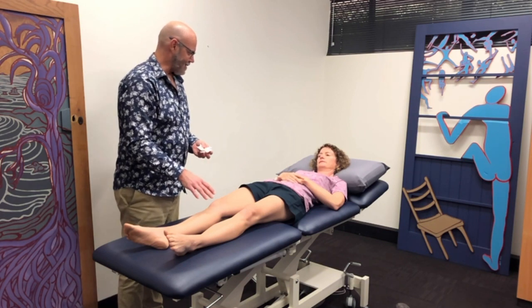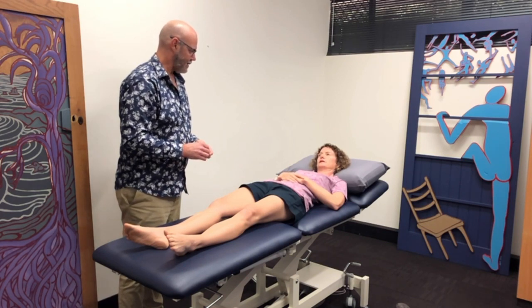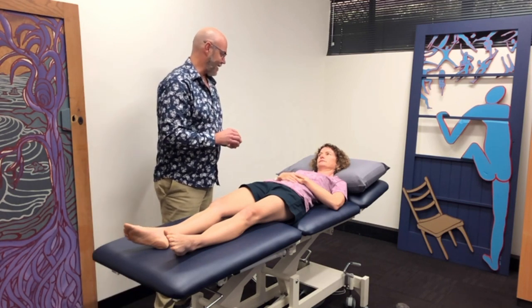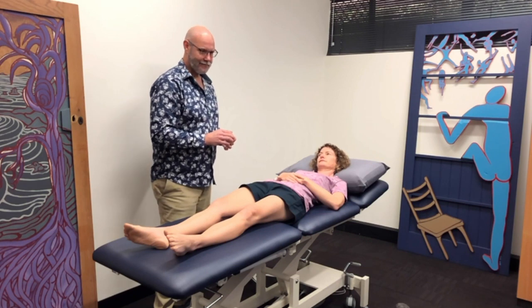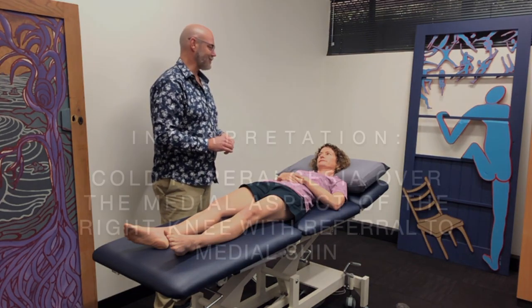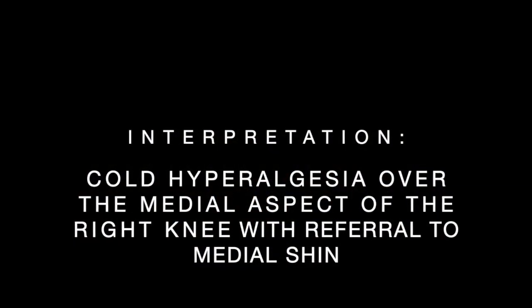I've taken it off now. What's happening? It still feels like it's on there. Yeah. Sometimes the ice can linger for a little while. Does it feel like it's settling? It's less — it's not gone, but it's less. Okay, we'll just give it a bit more time and I think that will settle.